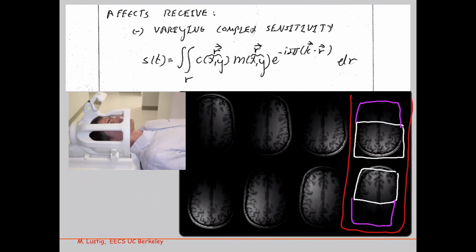Thank you. Let's see. What would happen to the image? We get artifacts related to the undersampling. Yeah, you get aliasing. And I'll get basically the image replicated. And then the black stuff will overlap with this. But the black stuff overlaps with this. And then this will overlap with the black stuff. So really, it doesn't affect much. It basically narrows my field of view.